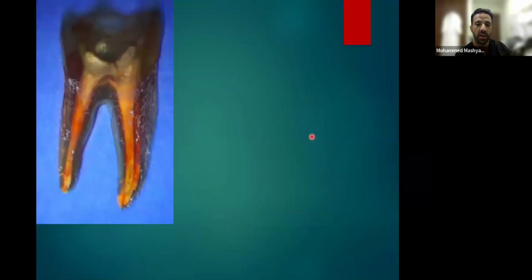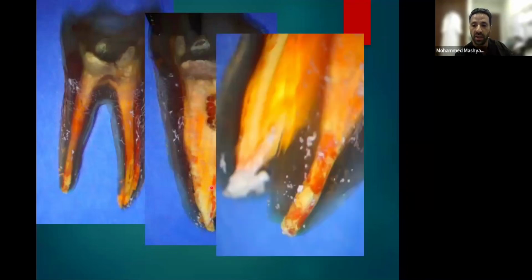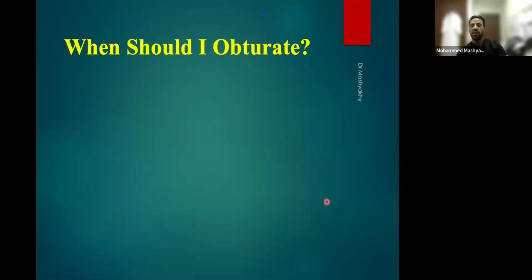See, this is the periodontal ligament outside. You see the mesial root, how it looks like? It's completely joining. See? And this is the distal. Even in the distal, you see another lateral canal in there. Beautiful. So all of these, just to tell you how it looks like from inside.